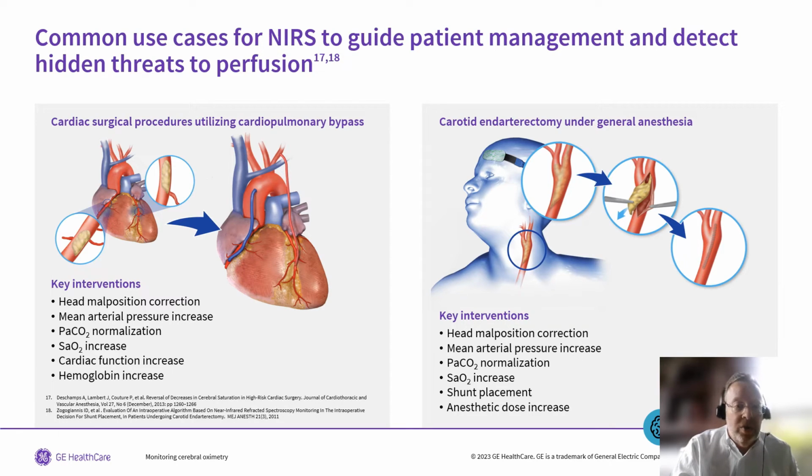In fact, it usually takes more than one intervention when a patient has experienced a clinical desaturation event. The majority of the time it requires multiple interventions to reverse this. However, most of the interventions in this algorithm primarily focus on improving supply of oxygen to the brain in both of these scenarios.